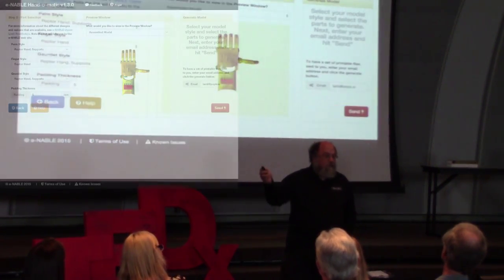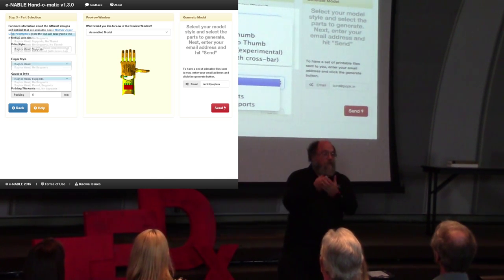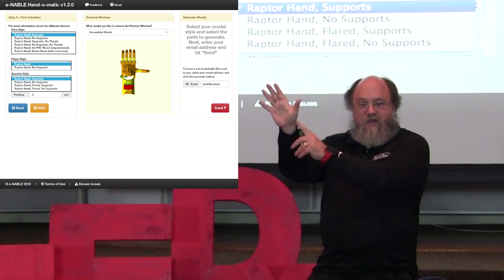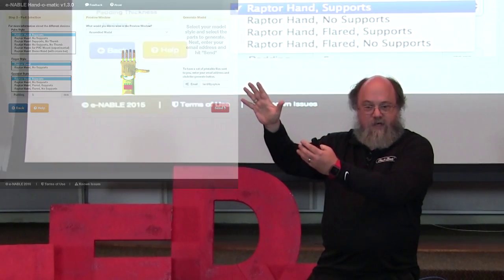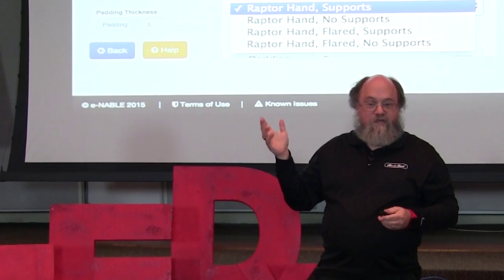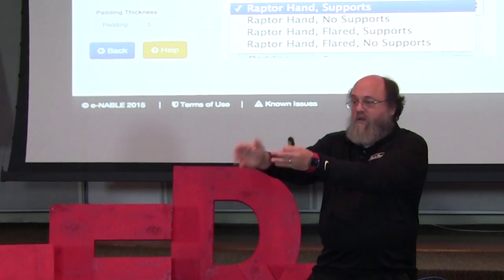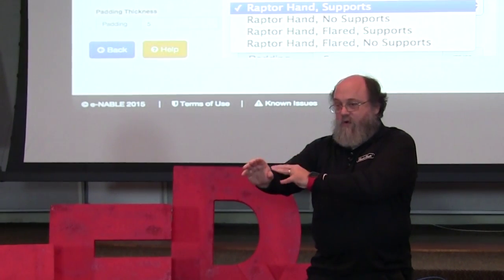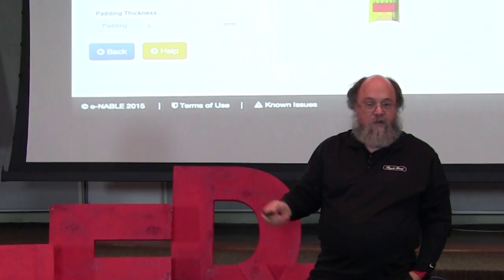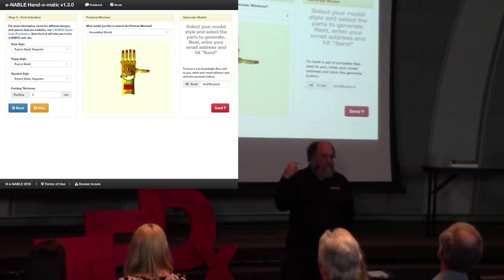And then it goes to a screen where you can pick a few options. So for example, do you want the hand with no thumb, meaning you've got a thumb and it should have a cutout so that your thumb sticks out? Or you don't have a thumb, so you need the printed thumb. And things like that. And same thing on the gauntlet, we call this part, on the arm. Maybe it goes straight, maybe you have a little more muscle mass and it widens out. And so you pick those sort of options. You can see exactly what you're going to get when you change the options. Everything updates in real time.